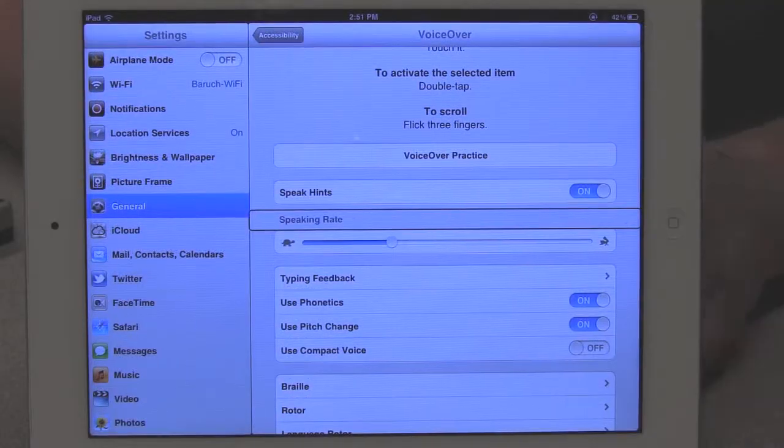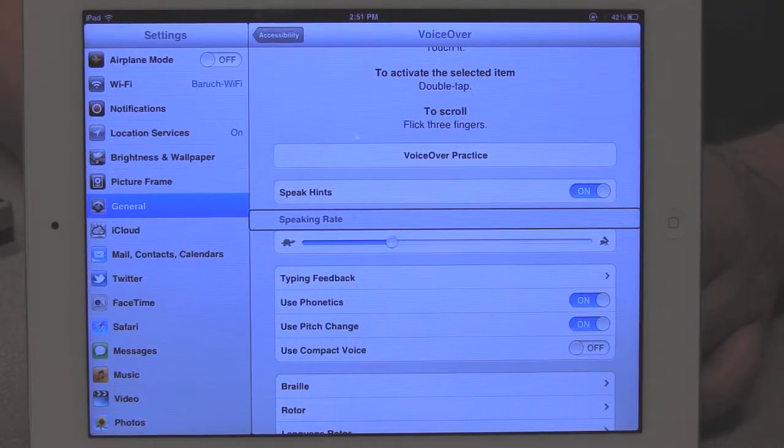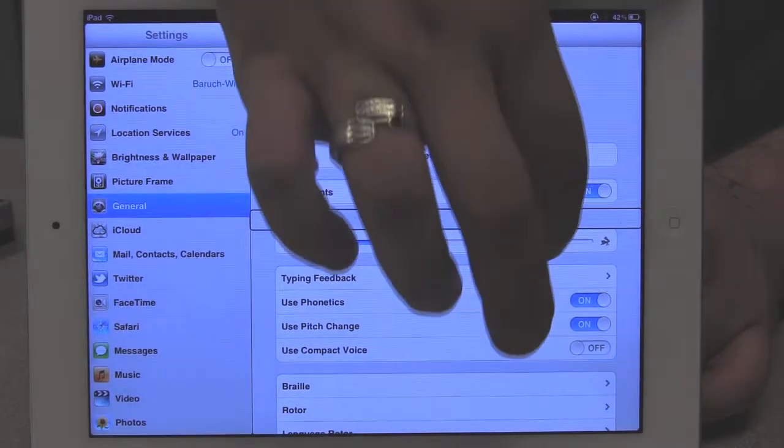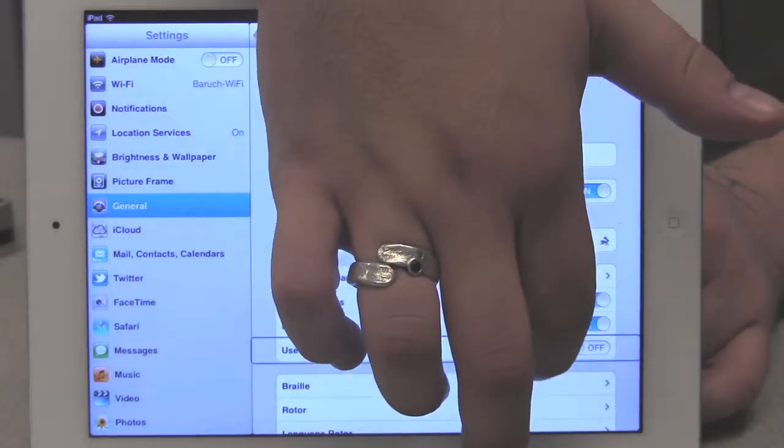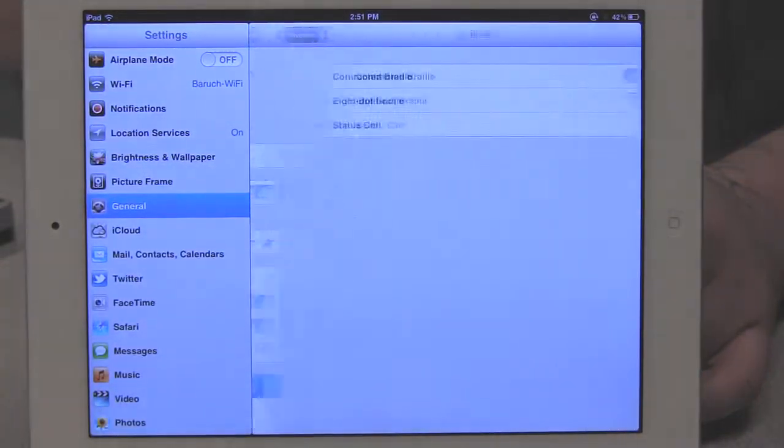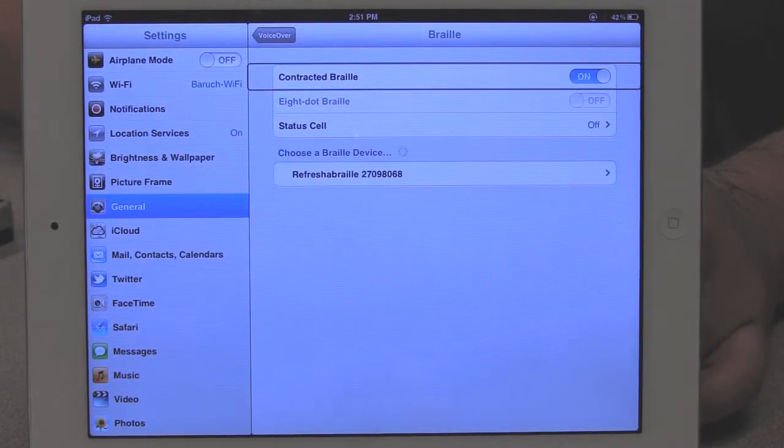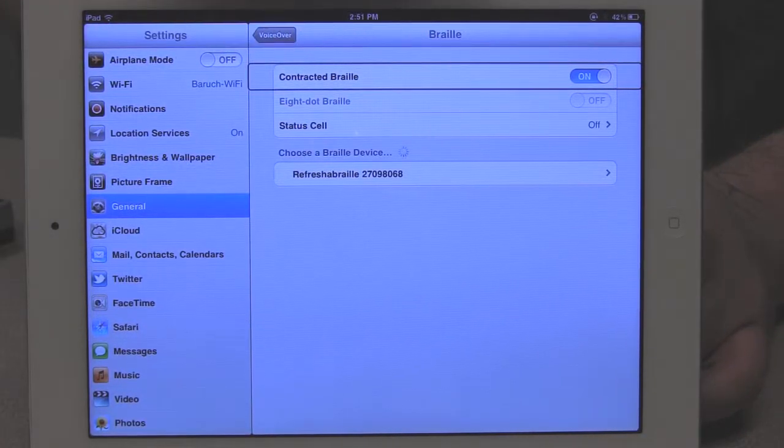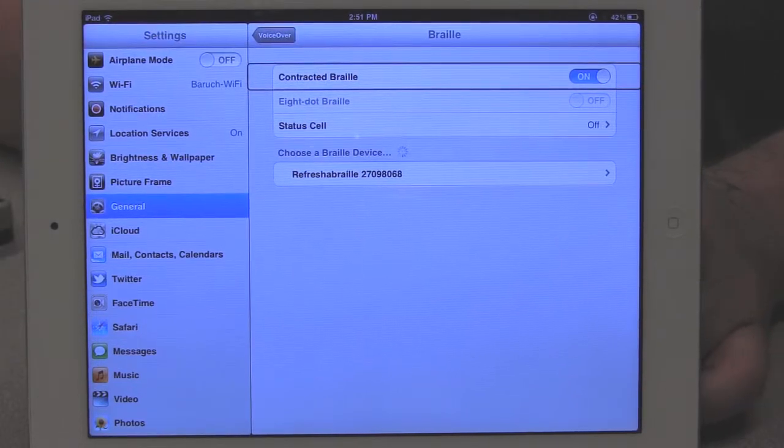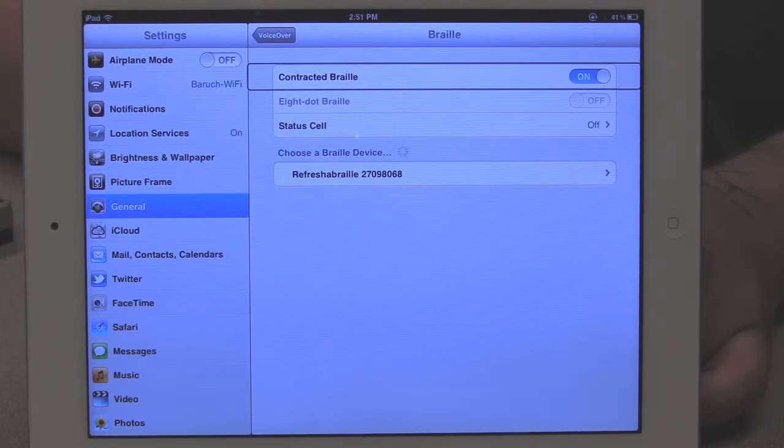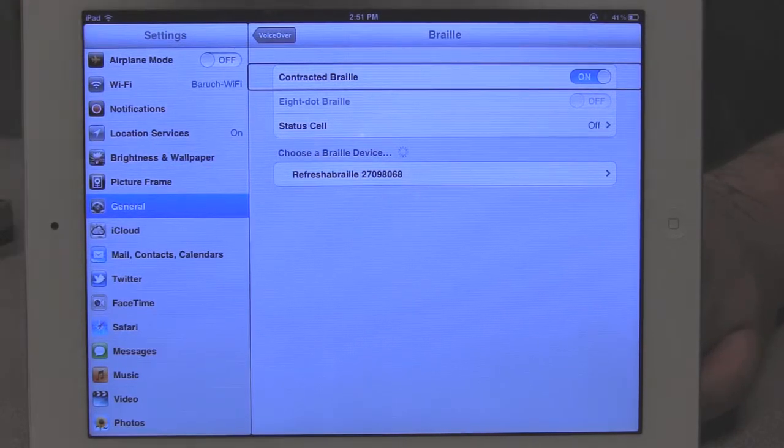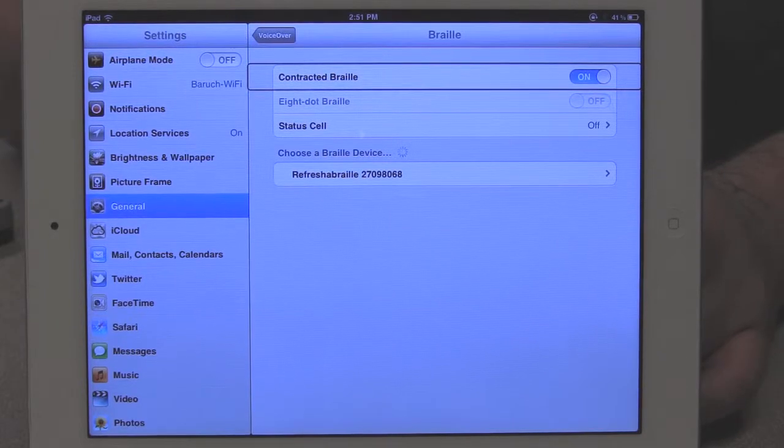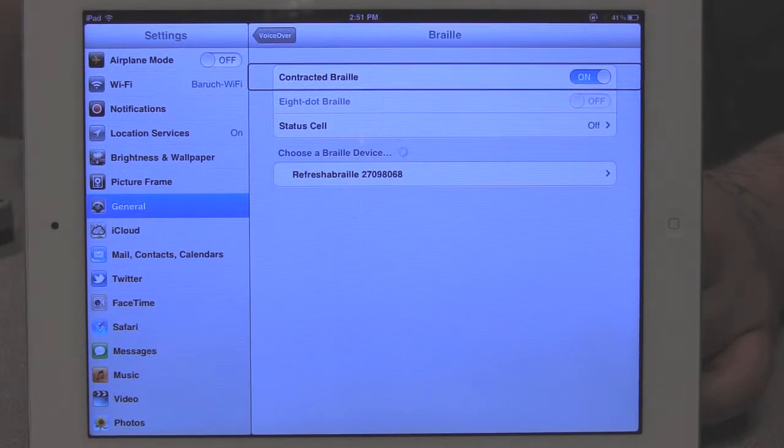So now from the VoiceOver screen, I'm going to find the Braille button and double tap it to open the Braille screen. There are also some other settings for the particular Braille device that you might be using that you can tweak here or customize to your own needs. But we're going to be looking for the list of available Braille devices on the lower part of the screen.